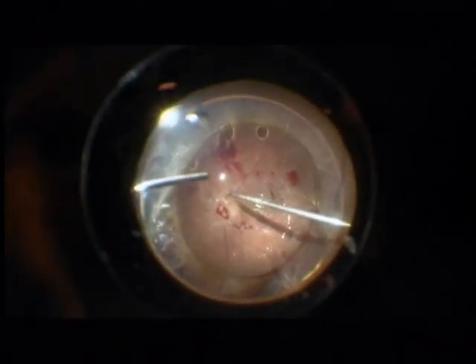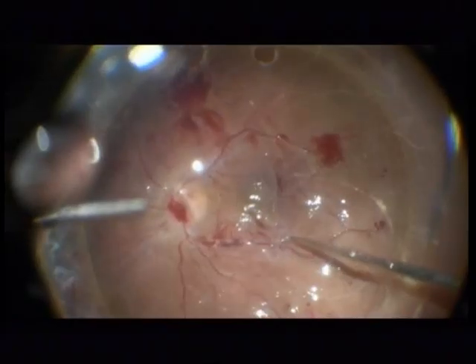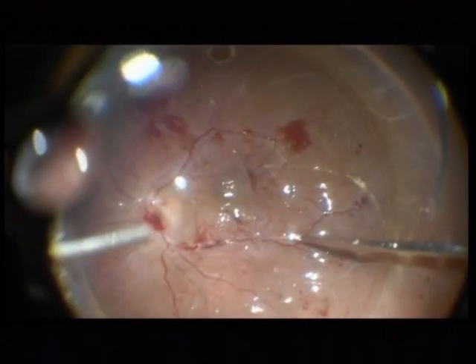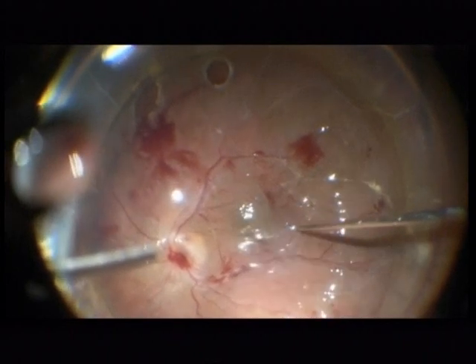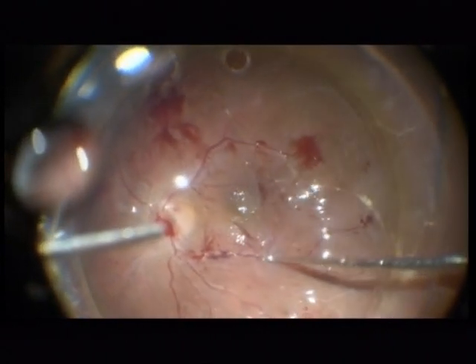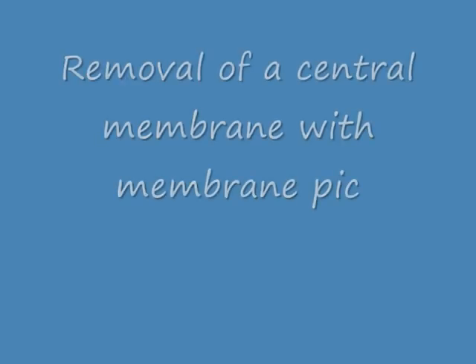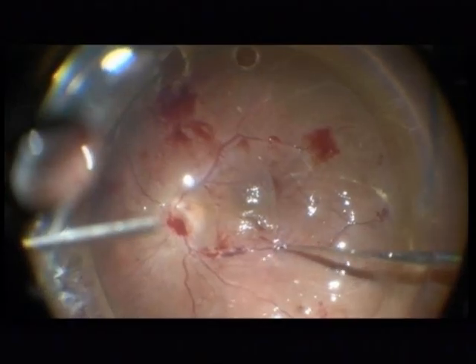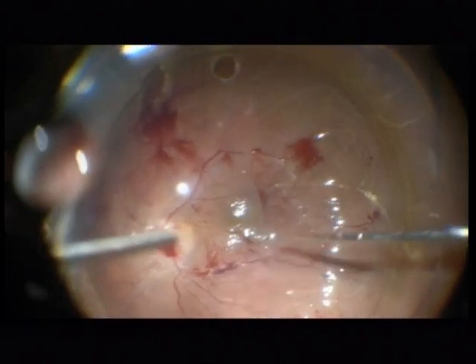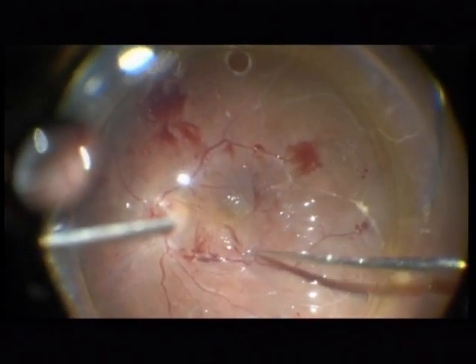I am looking again at the nasal pole. Now I am injecting more perfluocarbone. There is a traction on the superior arcade which I try to remove with a membrane pick. I work under perfluocarbone, which is easier. If you want to stain the membrane, you must remove the perfluocarbone, stain with membrane dual, inject the perfluocarbone again, and then do the peeling.